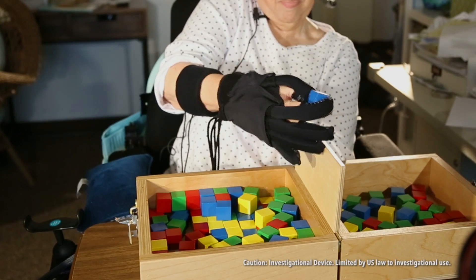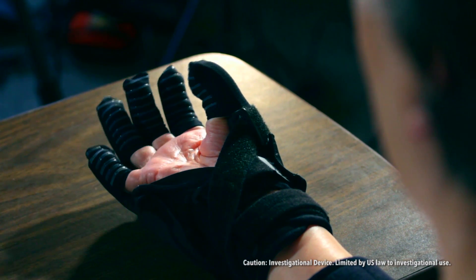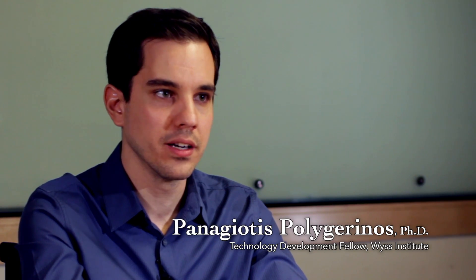Using soft robotics, you can make a device that's a lot lighter and that is a lot easier to align and to put on to a person's hand, and ultimately we believe will also be more comfortable for the user. For people with weak hand strength, simple tasks are everyday challenges. Their hands most of the time are very weak and their fingers are very flaccid.